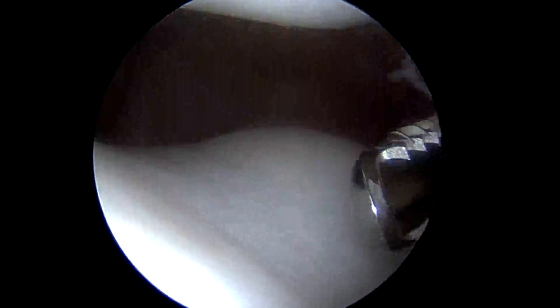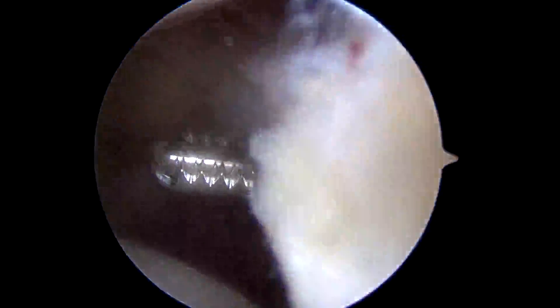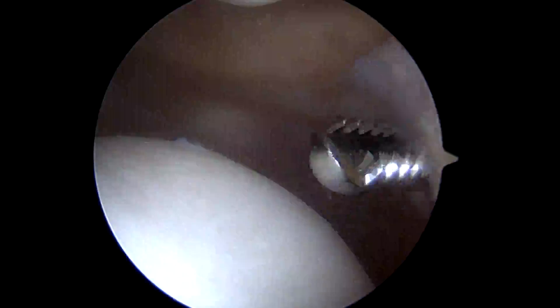So here's the medial side. I don't see any significant plica — there's a little plica there, but that's really not a clinical problem. Normal anatomy there.